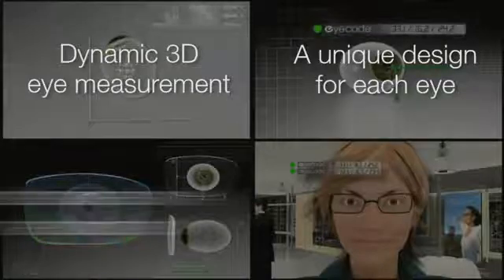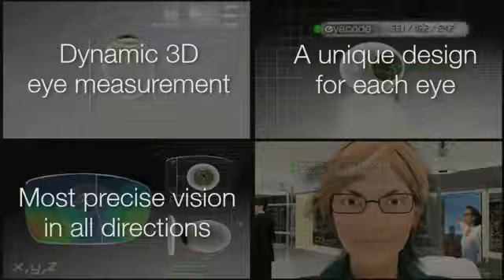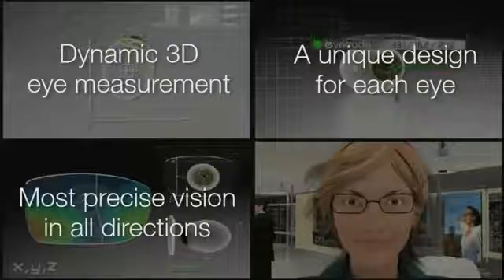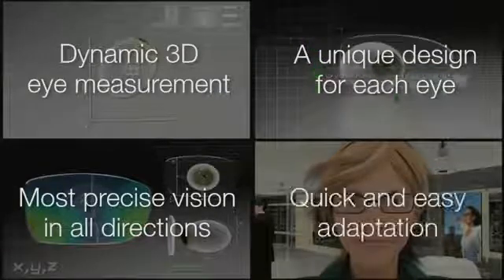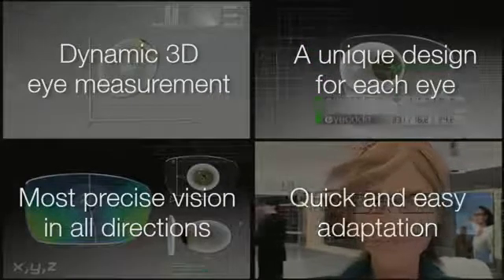Eye code's physiological individualization, whether it's for Verilux or Essilor single vision lenses, gives the patient the most precise vision possible, no matter where they look.